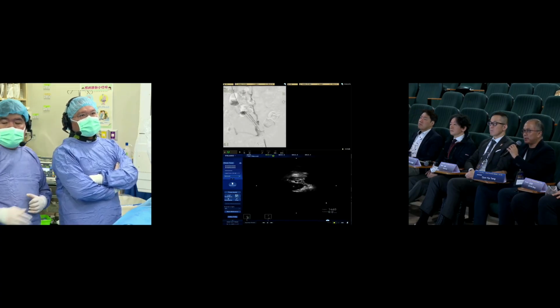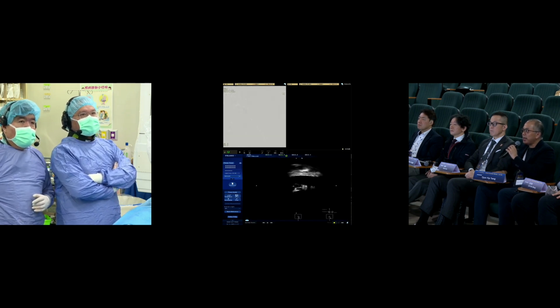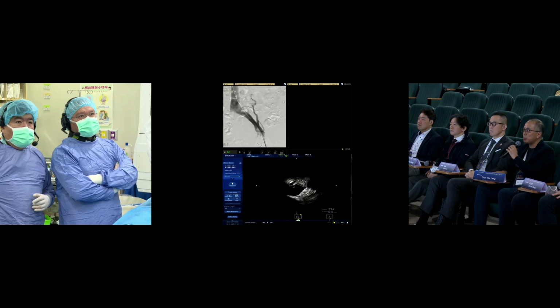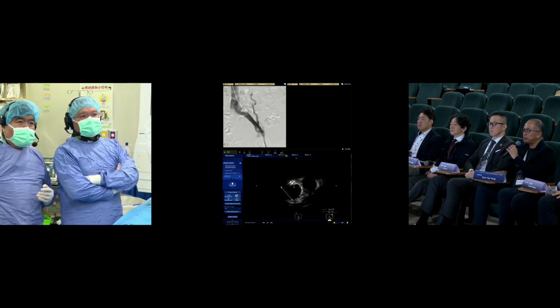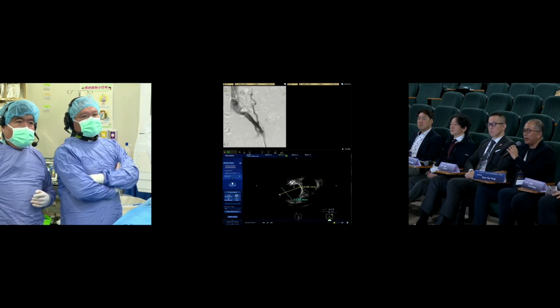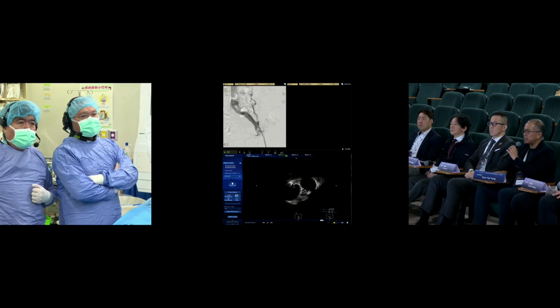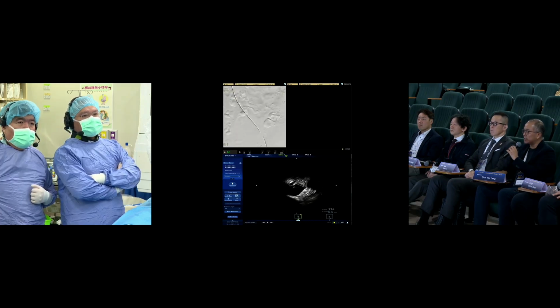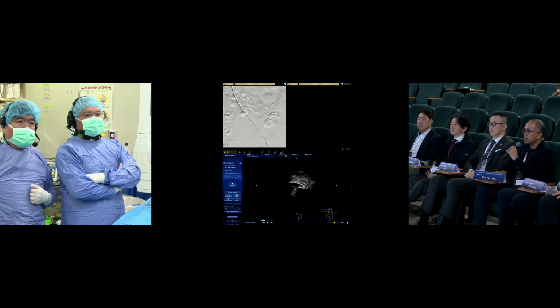No, no other point. Just focal stenosis. Can I ask you, the indication for treatment is just left leg swelling, is that correct? There are no wounds, no venous ulcers, no symptoms? It's just mild swelling. Has the varicose veins or CVI, the GSV or SSV reflux, been treated already before we go to this? No.